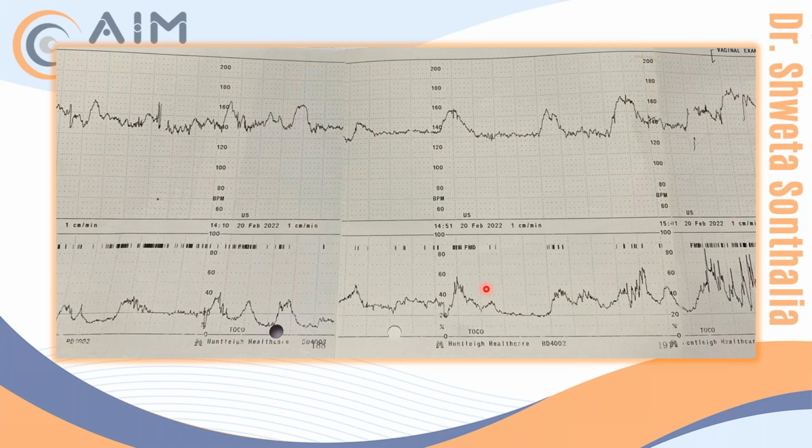Very good. If you see the contractions, 1, 2, 3, 4, 4 contractions, 1, 2, 3, 4, 4 to 5 maybe. This is small if I consider it a contraction. So good. This is a normal accelerative trace.